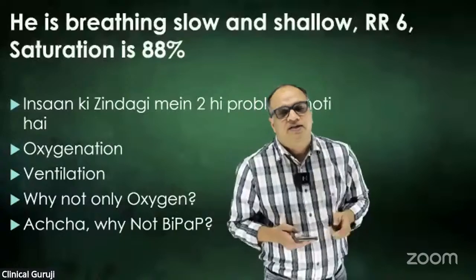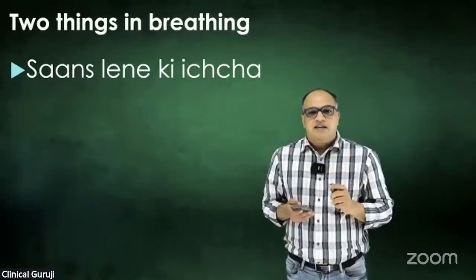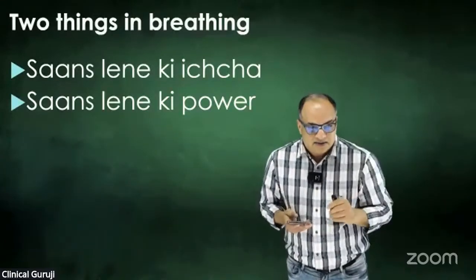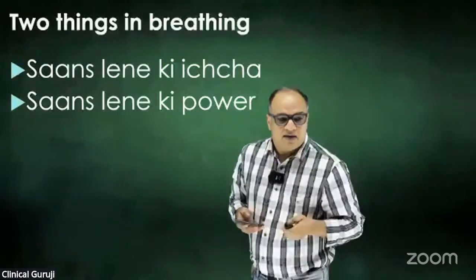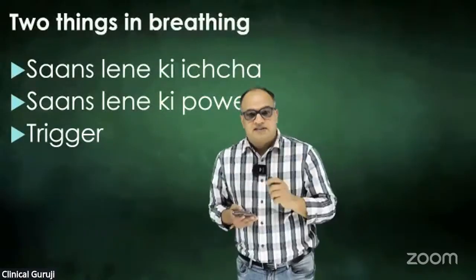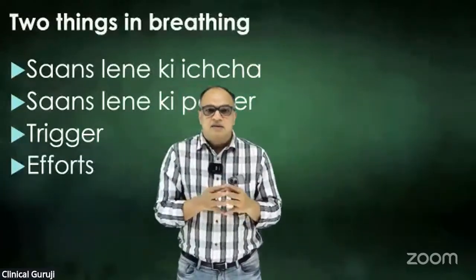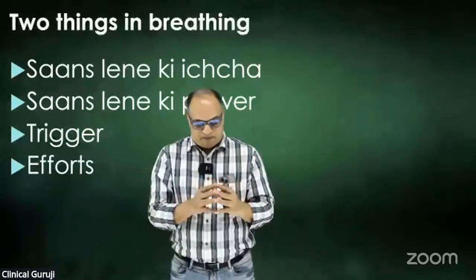Now there are two things in breathing. One is the desire to breathe and the other is the strength to breathe. Educated people call it trigger and efforts. The problem with this guy is with his triggers and efforts both.